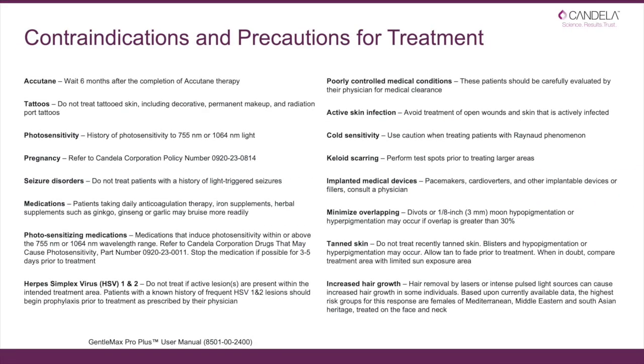Prior to performing laser hair removal treatment, ensure that medical history has been reviewed, treatment consent has been signed, and patient does not have any contraindications to treatment. Review pre- and post-care instructions and answer any questions the patient may have.